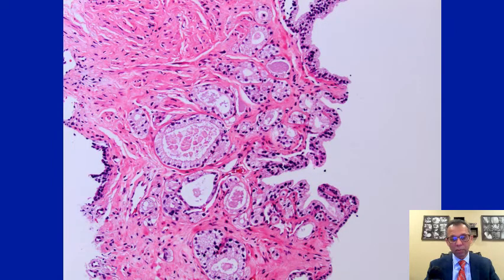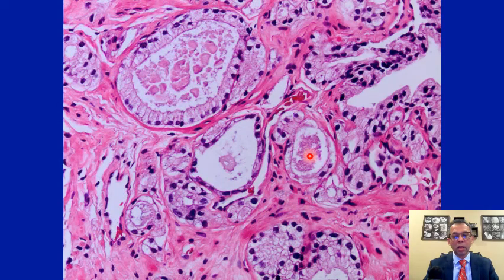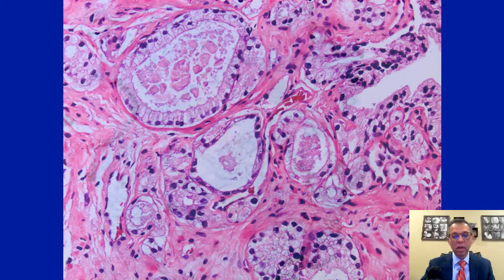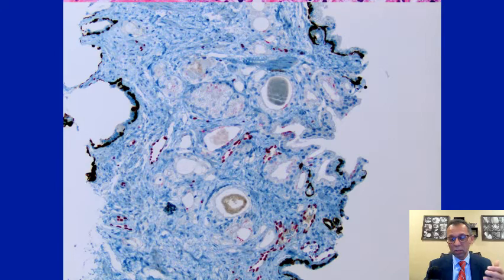Here is a nice example that on first appearance looks like partially atrophic glands. These glands are clearly pale, with more laterally placed cytoplasm. They appear somewhat disorganized but overall lack infiltrative architecture. Their cytoplasm is essentially the same pale appearance as the adjacent benign prostate gland. I always emphasize to residents to compare with the adjacent benign gland — this lesion appears more like partial atrophy. But when I stained this lesion, I found a complete lack of basal cell staining with some AMACR expression. This is the type of situation where after doing immunohistochemistry you start feeling uncomfortable and may not feel right calling this partial atrophy.